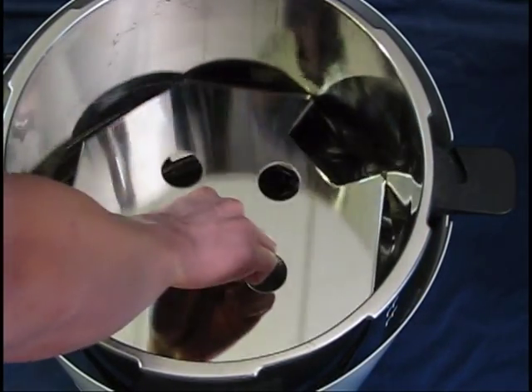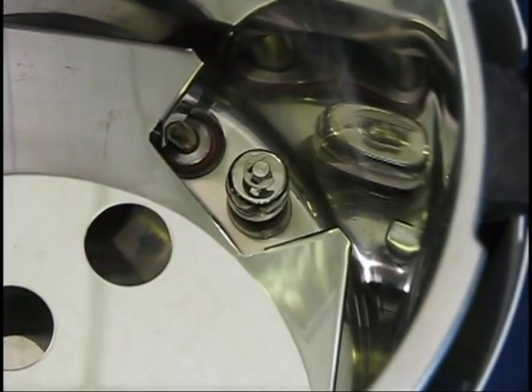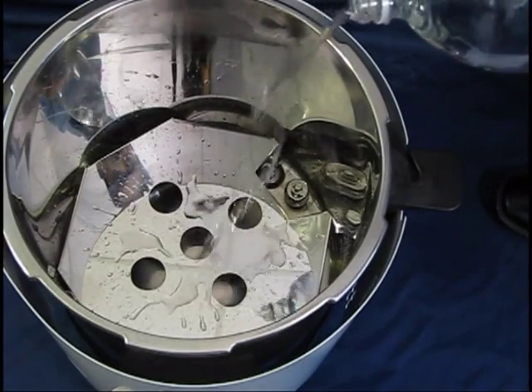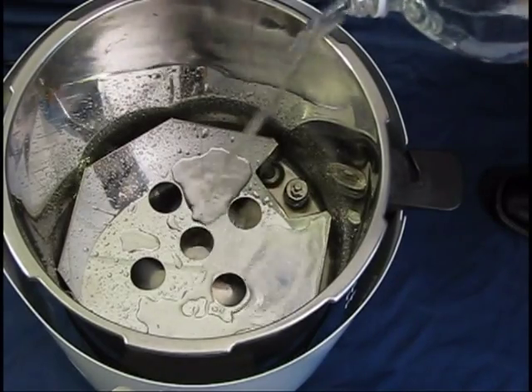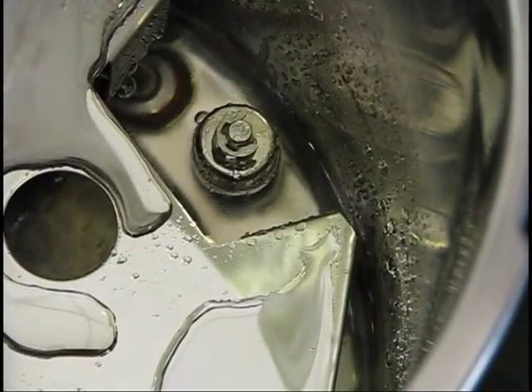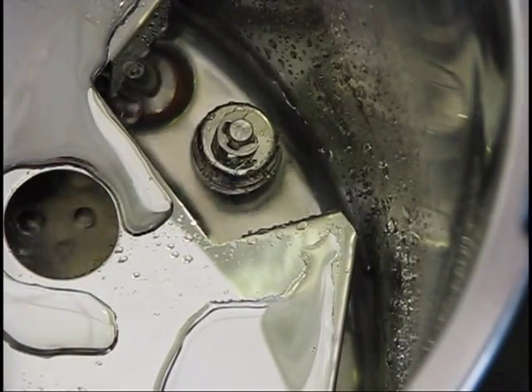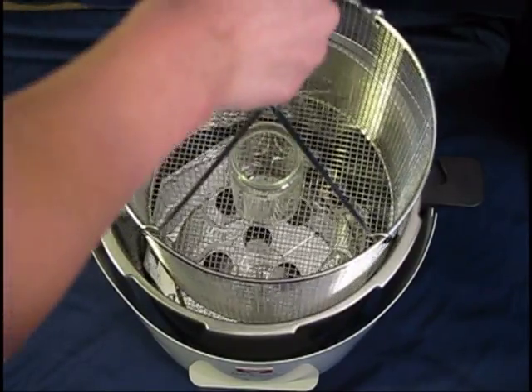Place the bottom plate into the chamber with the cutout aligned with the float sensor. Fill the chamber with enough water so that the float sensor reaches the top of its post, typically about 3 liters. Always use distilled water. Place the basket into the chamber and load your sample.